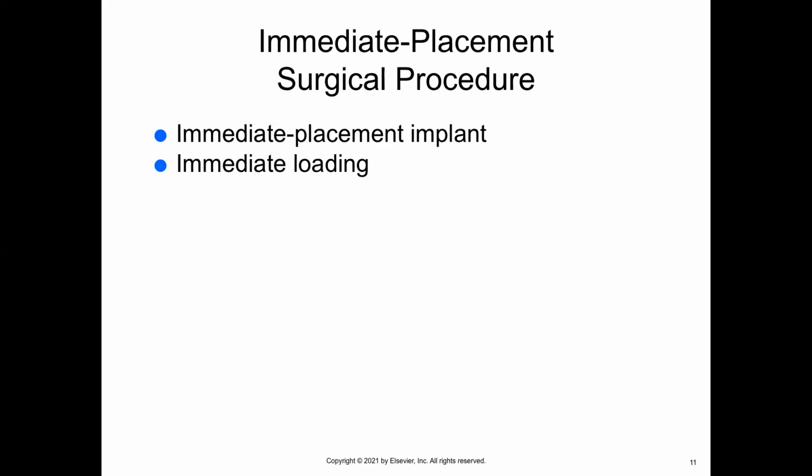The whole implant process can take anywhere from 3 to 6 months to a year from start to finish. We won't go into the restorative phase or impressions needed, but I want to talk to you a little bit about the different kind of retention the implant crowns have.